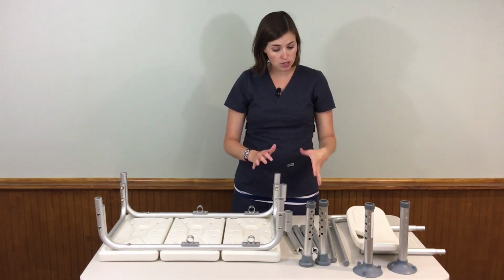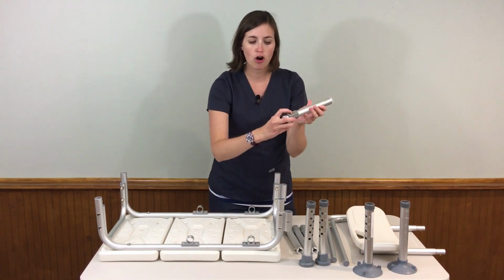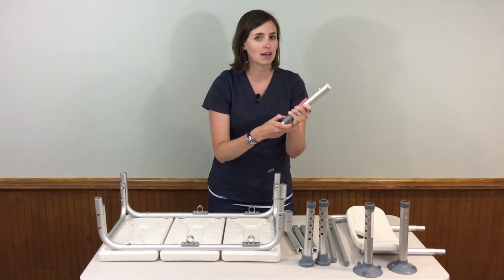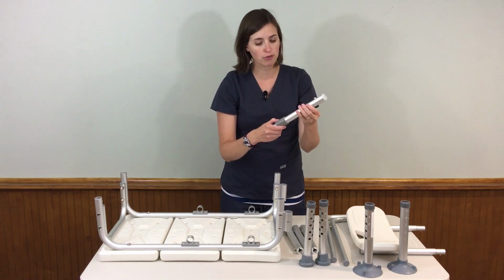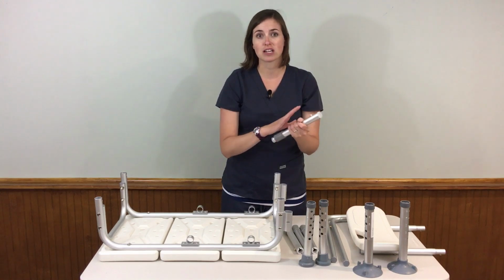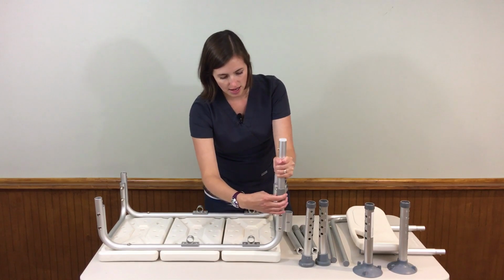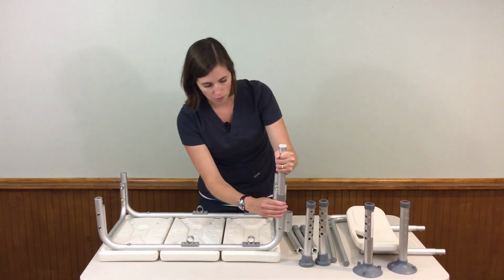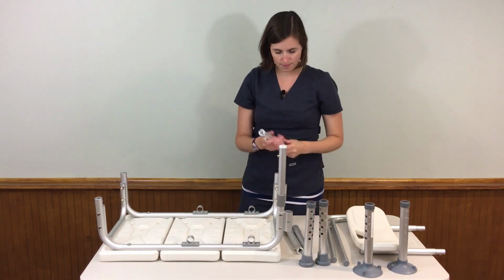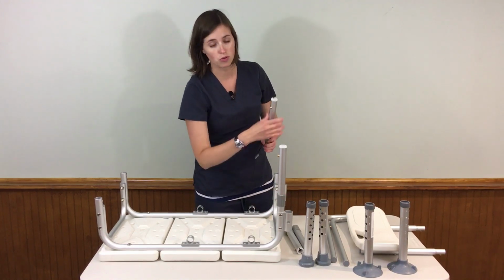So let's get started. I'm going to put on these leg extender pieces first. They're all going to be the click button type. These can get really tough to use if they've been sitting in the water for a lot of years or a lot of use, get soap scum in there or whatever. So if you need to, add a little CLR or something in there to kind of loosen them up, get them moving again before you try to reassemble. So we're going to slide these guys in, and we're going to go until we hear the snap. There we go. 1 in. And these gray neck pieces should be in place when you go to install.